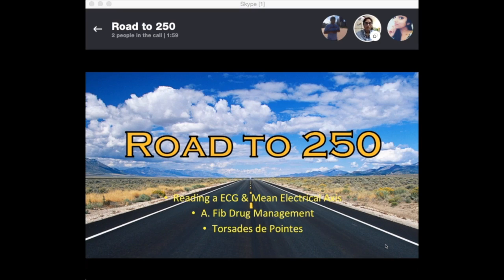All right, guys, so today on Road to 250, I'm going to go over reading an ECG and a little bit of how to do the mean electrical axis, AFib drug management, and then a little bit on Torsades.